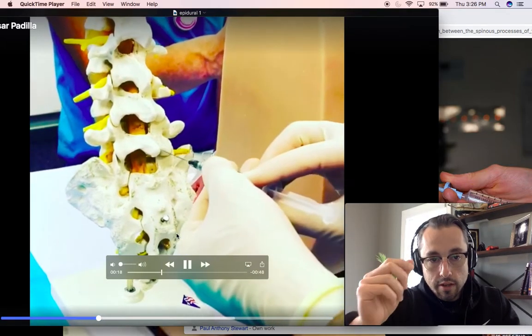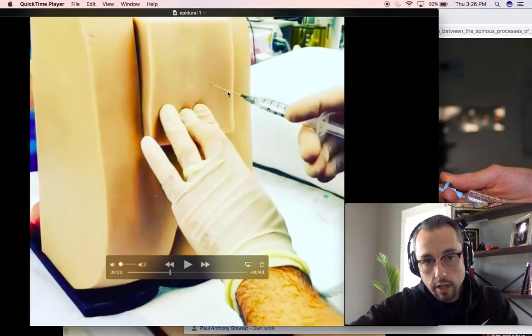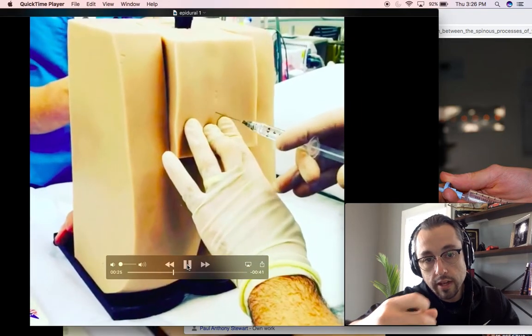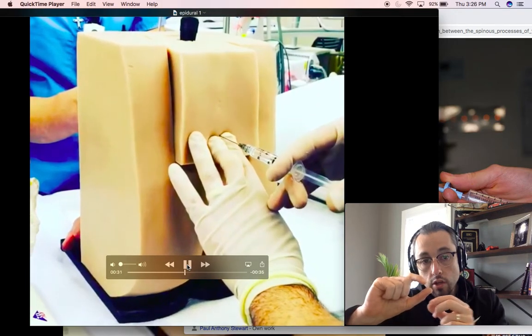But there's a degree of an art to it. What I'm doing there is using a local needle. They come in really small gauges, meaning a really small diameter needle. When you are numbing the skin, you can sometimes find that spinous process, and your midline. That's the spinous process, and you want to go in the middle.